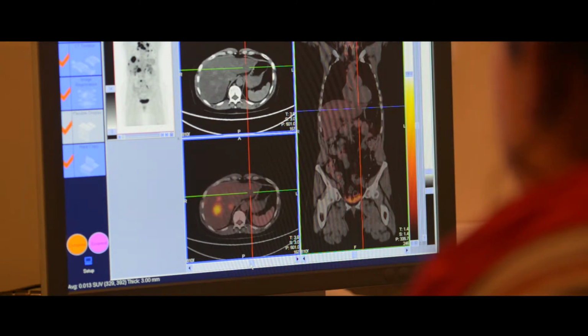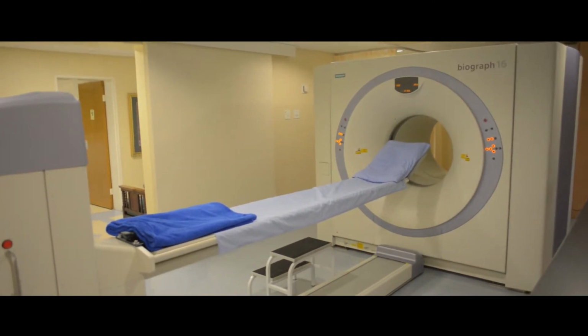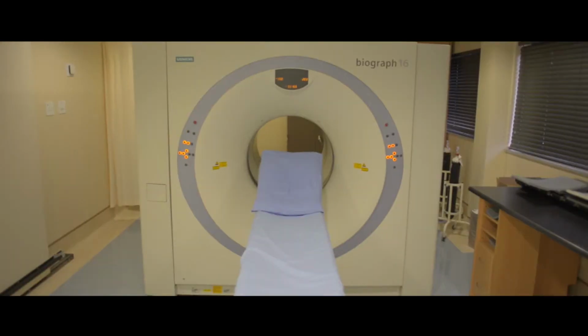Mostly we work with oncology patients. Basically all different cancers take up this FDG. Some of the cancers don't take it up that well, but we know which ones those are. However, it can also be used in infection imaging, also in inflammatory diseases.